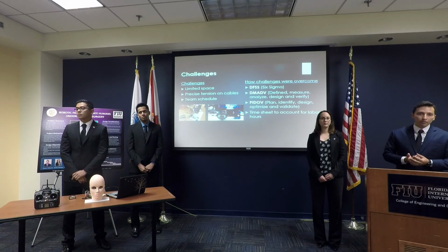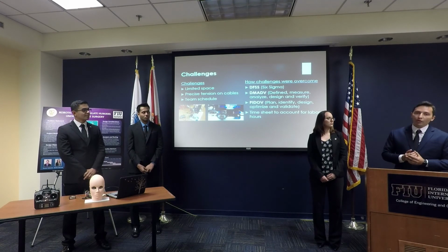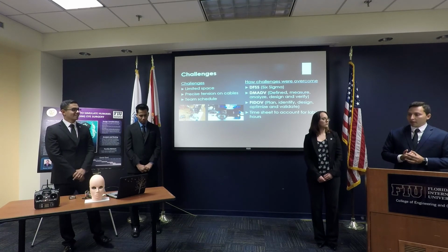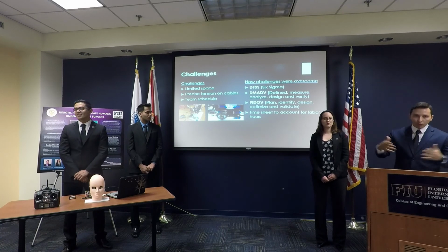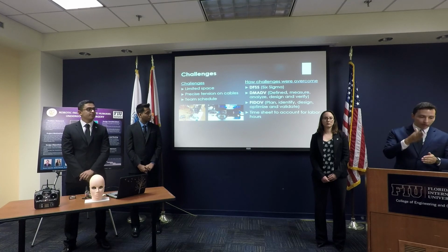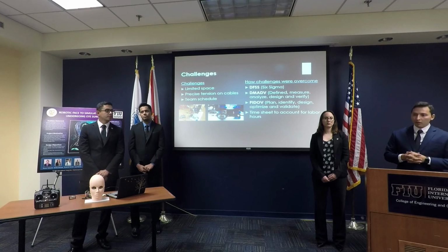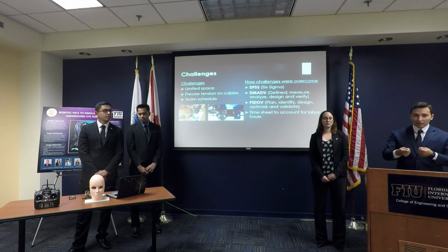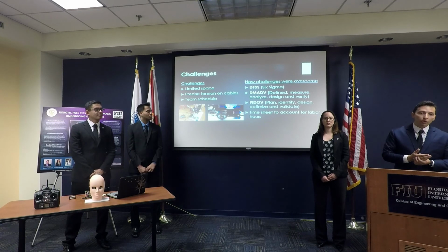So what ACE principles did you use? I can't recall the names right now, but that's basically the process. You get together with your group, you brainstorm, you divide the tasks, each one gets that done, and then you put everything together. That's how we solved the tension problem, because we were using fishing line first, and we saw that was not very effective because of the tension. So we brainstormed, and in the end we used cable for that.